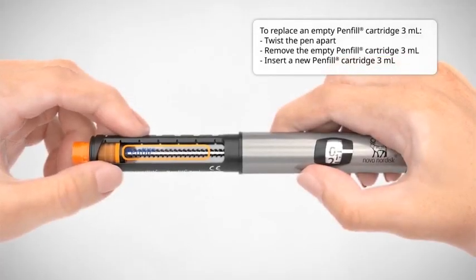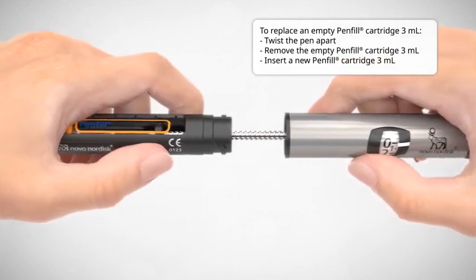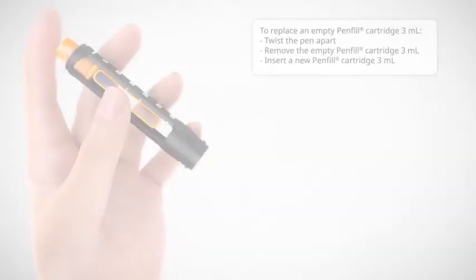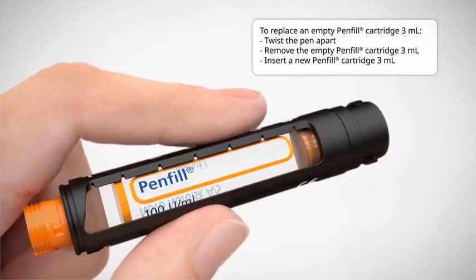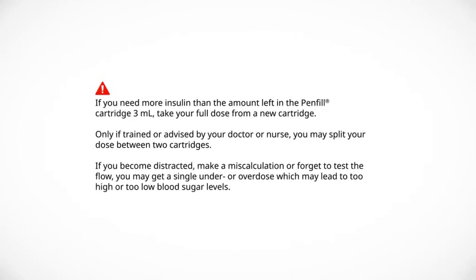When the Pen Fill cartridge 3 ml is empty, replace it by first twisting the pen apart. Then remove the Pen Fill cartridge 3 ml and insert a new one. If you need more insulin than the amount left in the Pen Fill cartridge 3 ml, take your full dose from a new cartridge. Only if trained or advised by your doctor or nurse, you may split your dose between 2 cartridges. If you become distracted, make a miscalculation, or forget to test the flow, you may get a single under- or overdose, which may lead to too high or too low blood sugar levels.